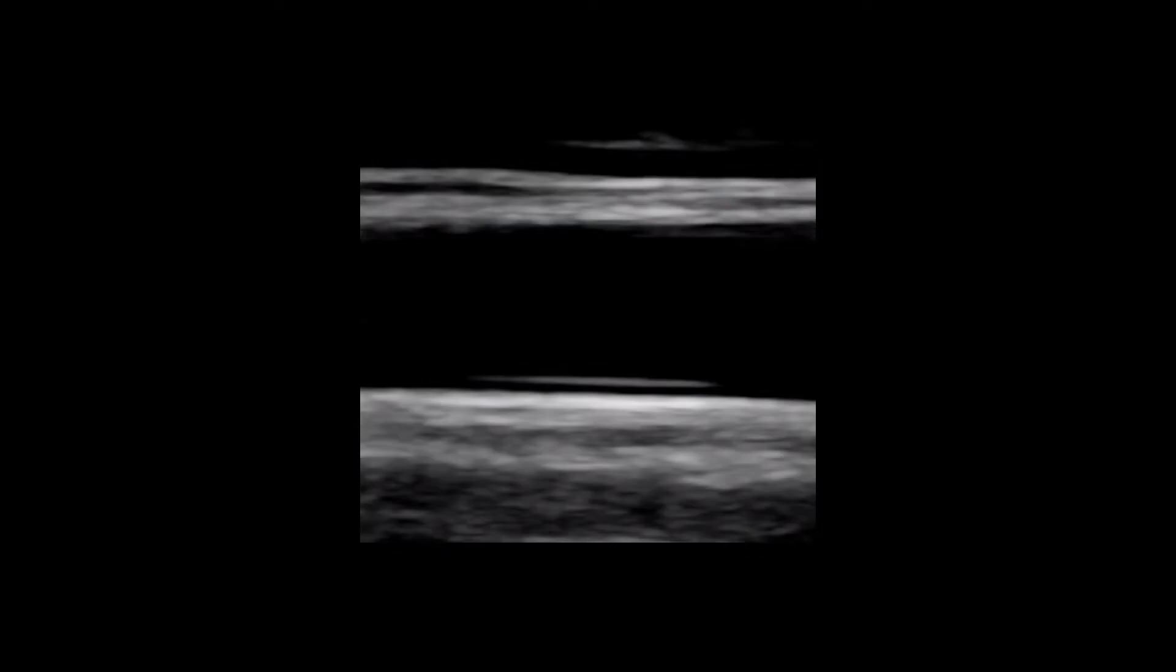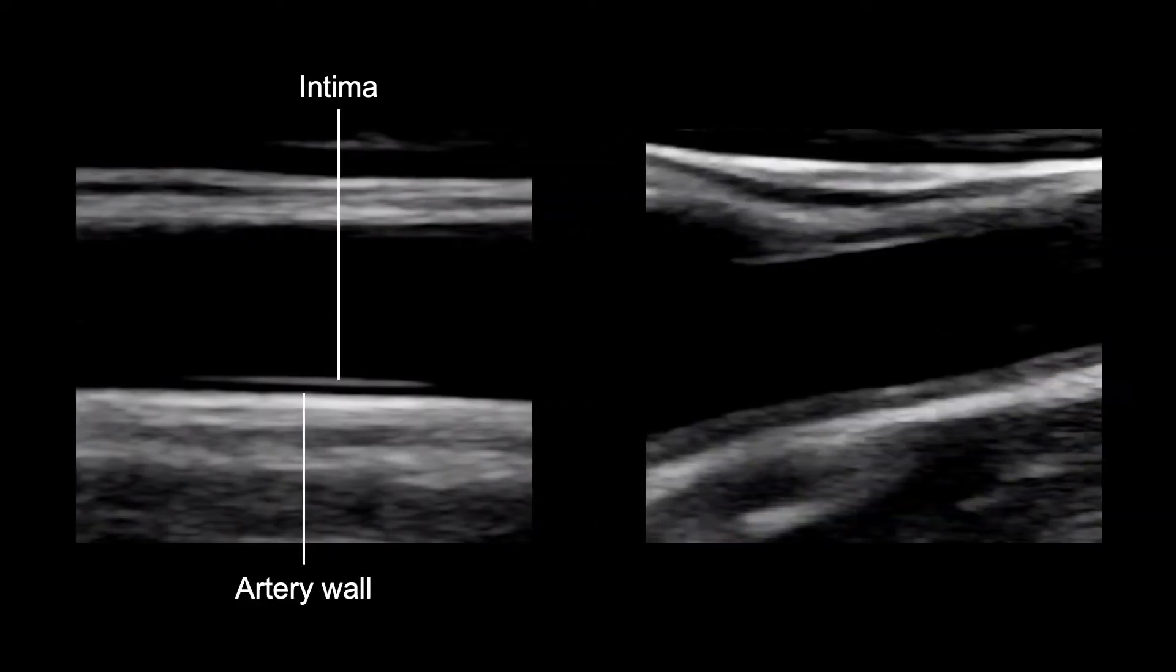The B-mode image provides a lot of useful information. In the normal CCA we saw that there is a clear gap between the intima and media in the walls of the artery. Early disease in the carotid territory can be recognized by thickening of the intimal layer which causes the clear gap to disappear. This can be visualized and documented with a high frequency probe.